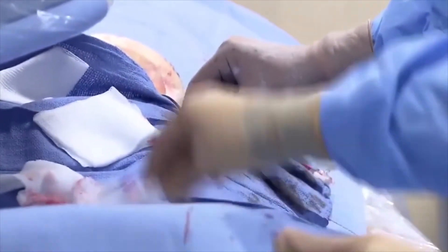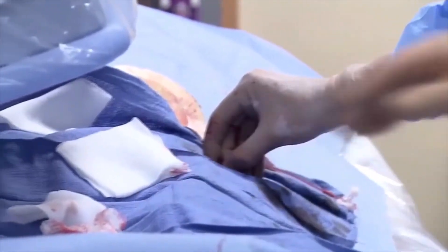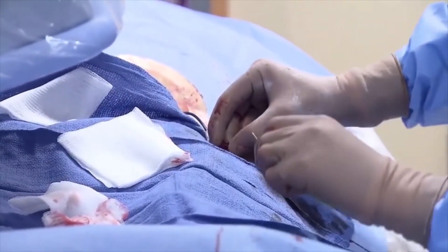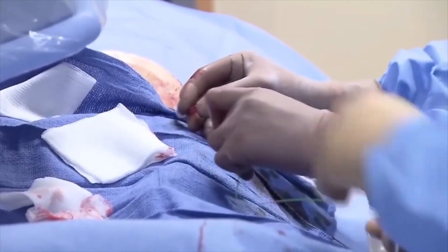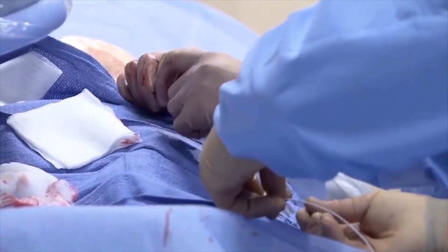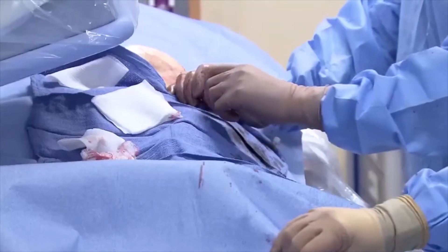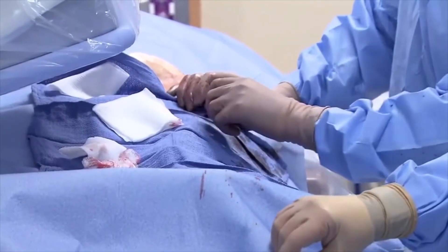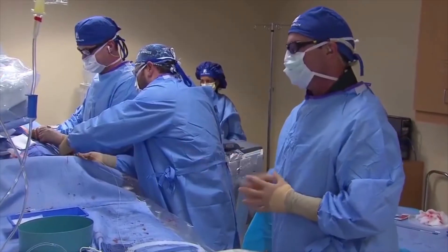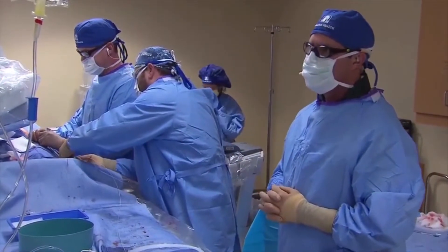From that point she underwent a simple blood pressure test called ankle brachial indices, or ABIs, which showed significantly diminished blood flow at the level of the left calf. From there she underwent a CT angiogram that documented the lesion in her distal left superficial femoral artery, and subsequently she arrived here and we're going to fix this lesion hopefully in a few minutes.